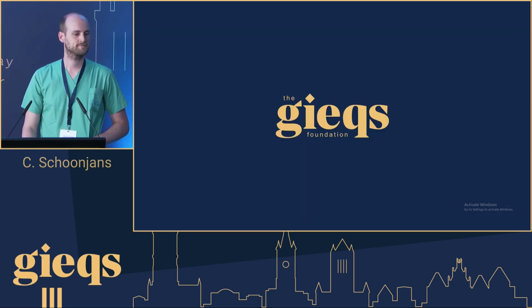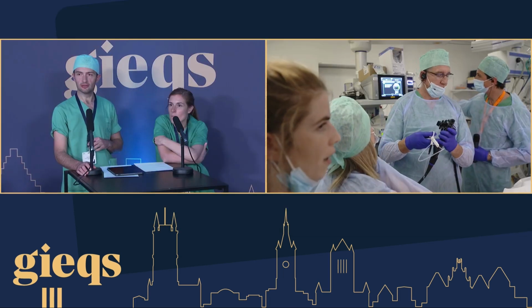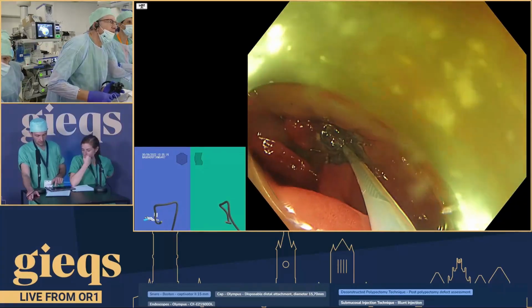Thanks, Christophe. Let's go back to Michael. He's just about to cut a piece off. Can we show the live? Yeah. Michael, you're back. But you've dropped a few points. I'm not going to lie, Michael, sorry.